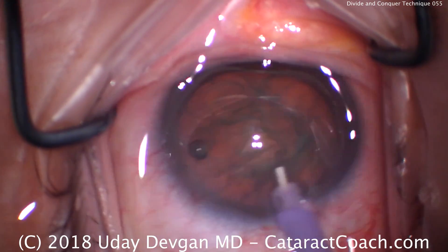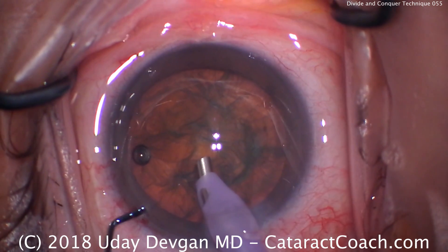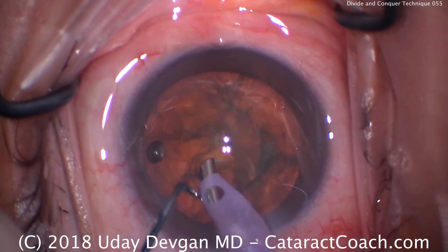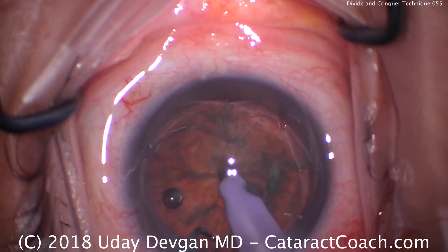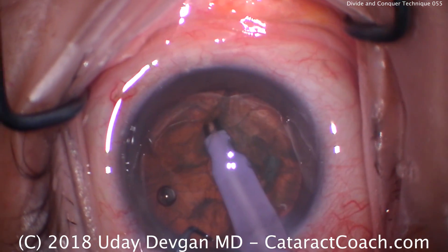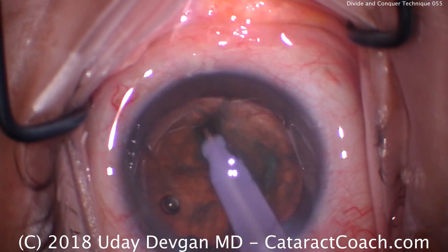This is our sculpt setting, so power in the middle — somewhere around 50% for this nucleus. If it's very dense you can go higher. Low flow, 25 cc's a minute; low vacuum, about 100 millimeters of mercury. There's the first groove. We go deeper in that first groove and now the sleeve hits the nucleus, so we have to widen it up and then widen deeper.